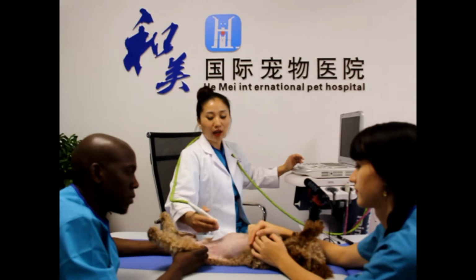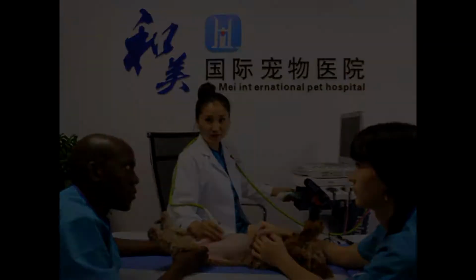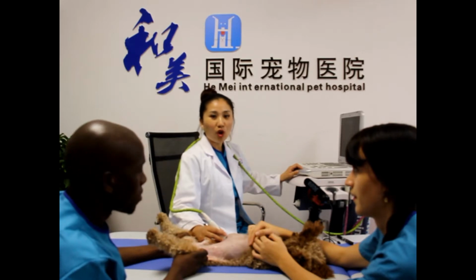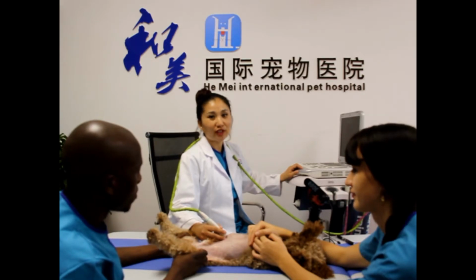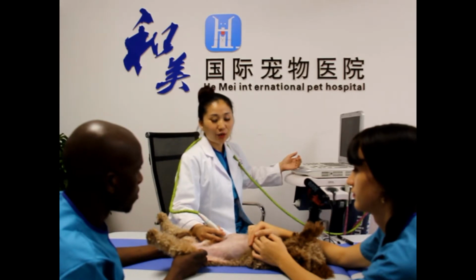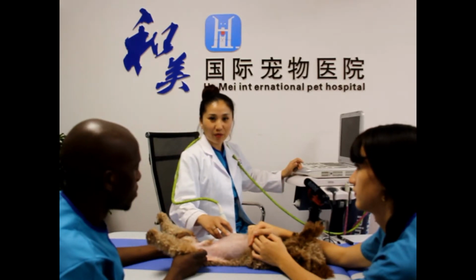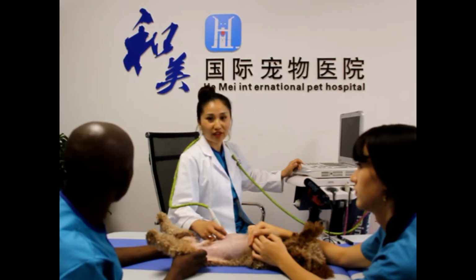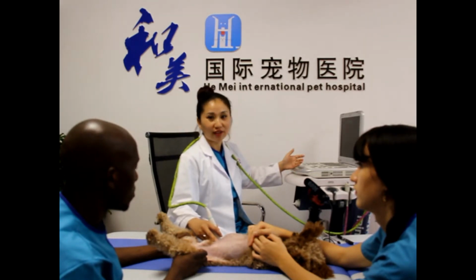So now I will show you how the right side of the adrenal glands looks for this dog. The right side is more cranial than the left side, and it is more difficult to find because of its more cranial location. Sometimes it's already below the rib, and gas in the stomach can also make it more difficult to find. But if you know how to find it and pay attention, you can find it.